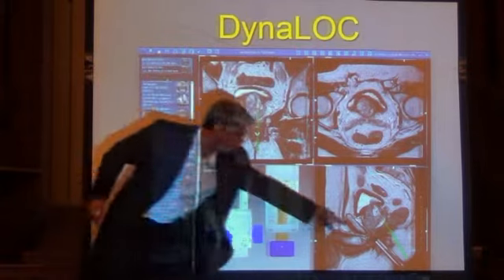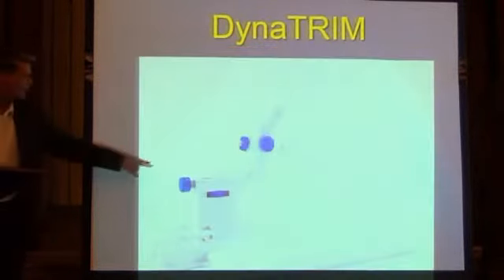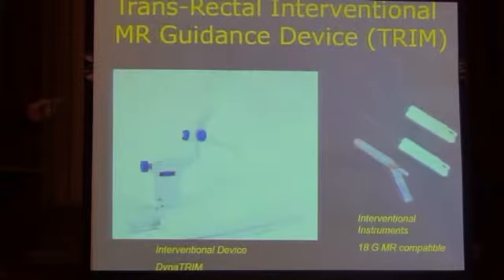It shows up real clearly on T2. So that's placed in, then they do a scan, then they take the target and they move the cursor to where they want to target. One more slide, and it tells you where to set this device right here, where your settings are, AP, left, right, up or down. Go ahead, one more. So it tells you where to put each one of these settings down there on the far right. It tells you exactly where to put the settings, and then they'll put the needle guide right down this, fire the needle guide one time, pull it out, and then they'll do a confirming scan.